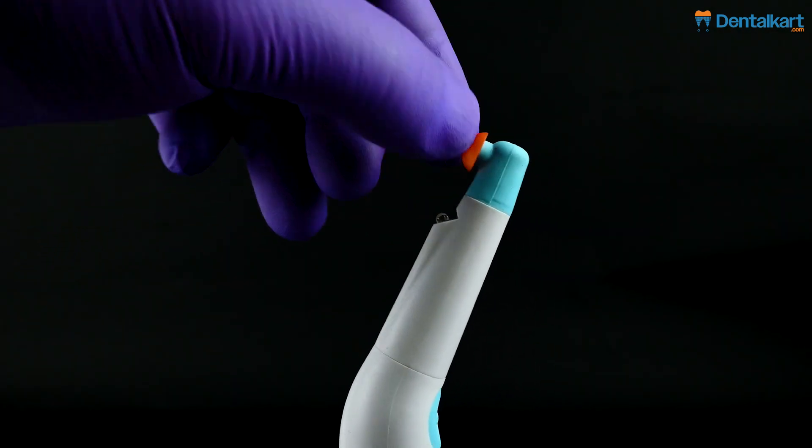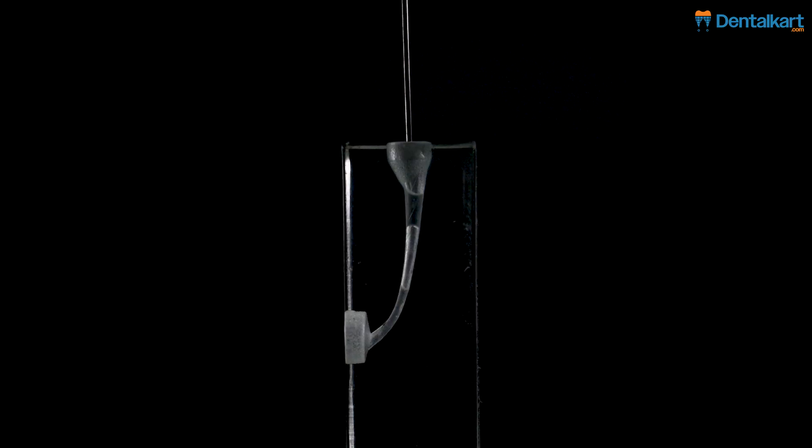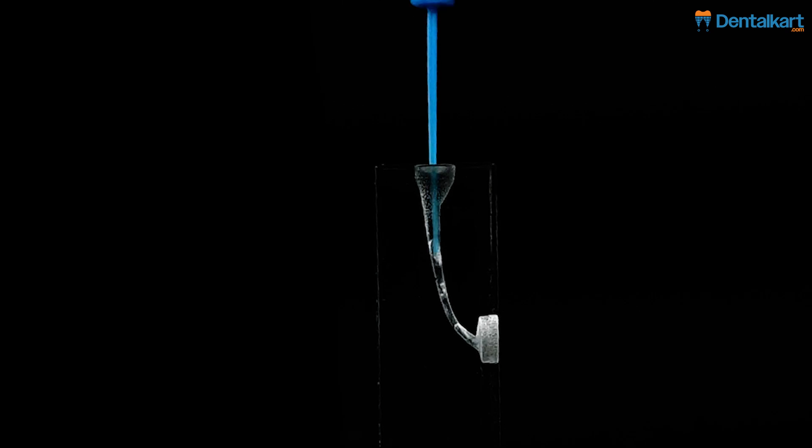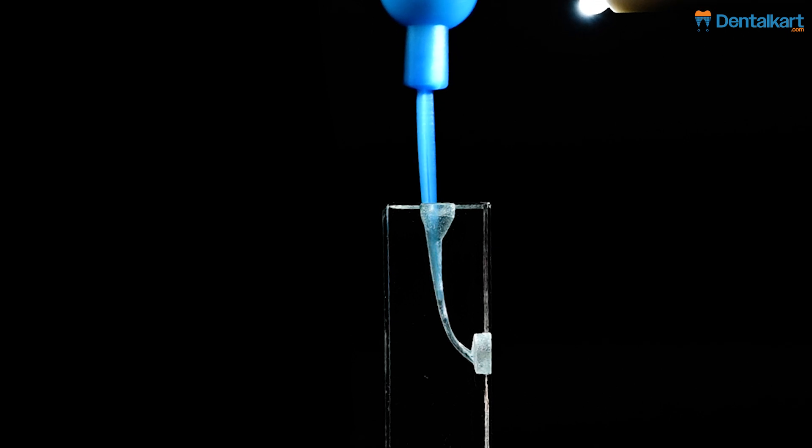Attach the appropriate sonic tip based on canal size and shape. Operating instructions: Fill the canal with an irrigant. Insert the sonic tip into the canal gently. Activate the device at a low frequency initially, gradually increasing as needed.